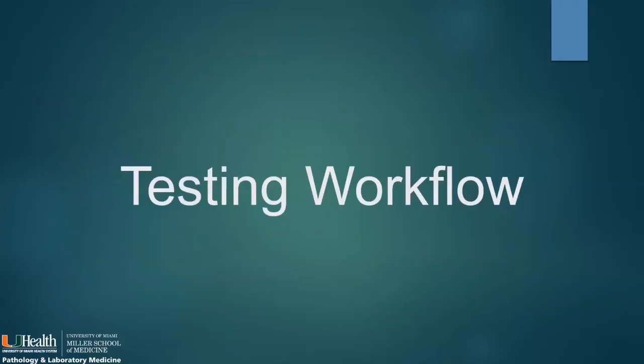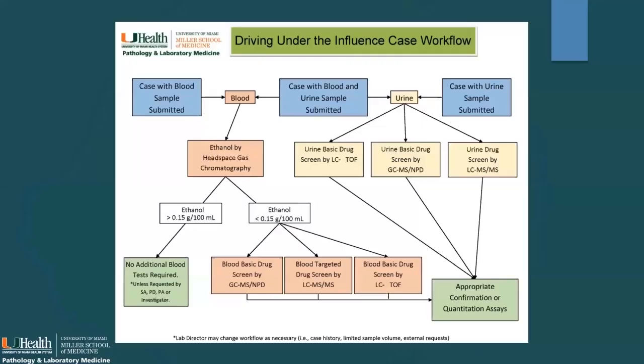So I'm going to start with a little bit about our testing workflow, just to give all of you an idea about how we're using our TOFs and how they come into our entire scheme for our testing. So the first we will talk about is the driving under the influence case workflow. We also are in South Florida, so we also have boating under the influence. I always just like to make a note of that.